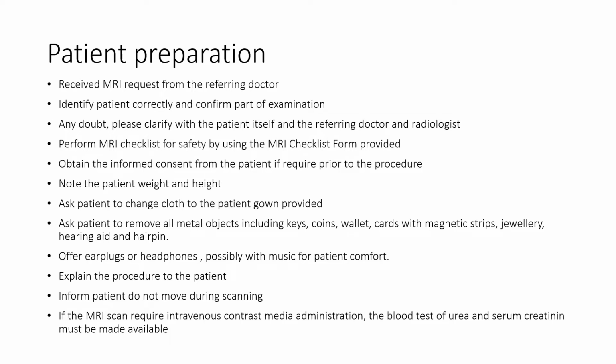The radiographer must perform the MRI checklist for patient safety using the MRI checklist form provided. Obtain informed consent from the patient if required prior to the procedure. Note the patient weight and height.